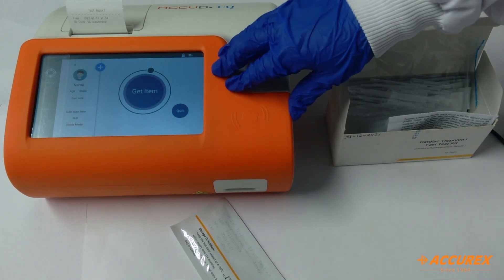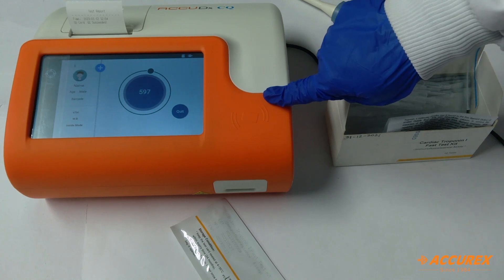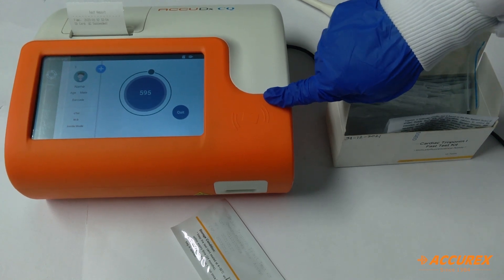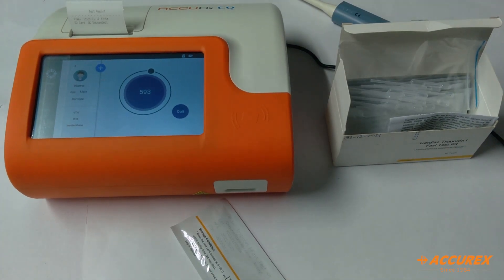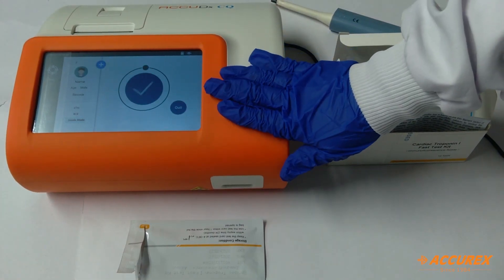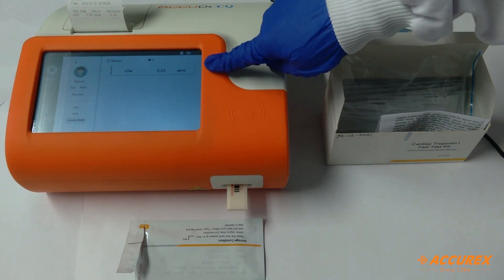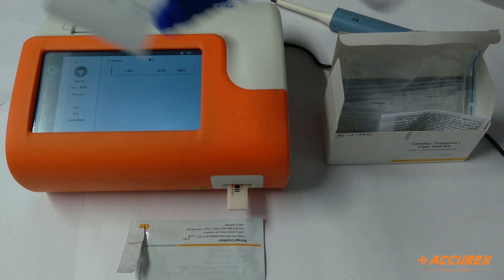First it will recognize the test strip and it will take 600 seconds to give the results, so until then we'll wait. After 600 seconds we'll get the result, which you can see on the screen as well as on the printer.